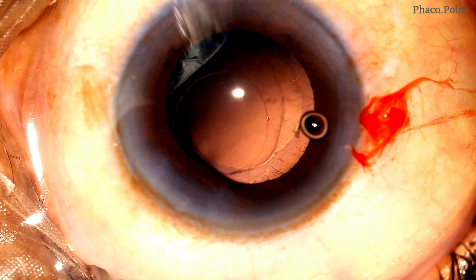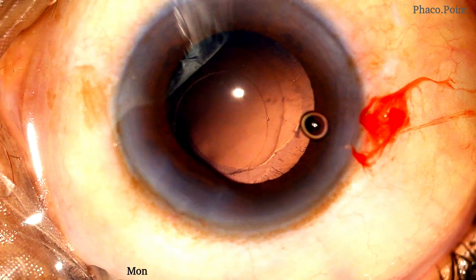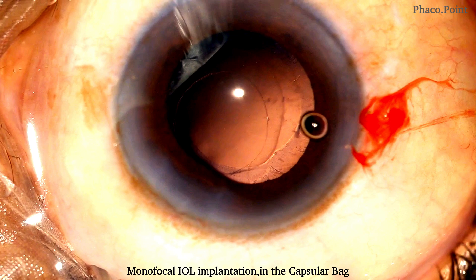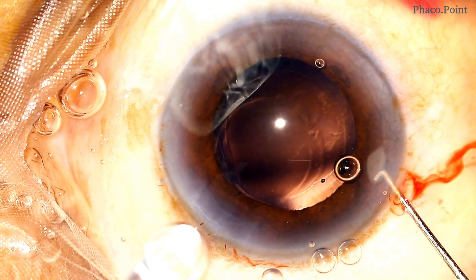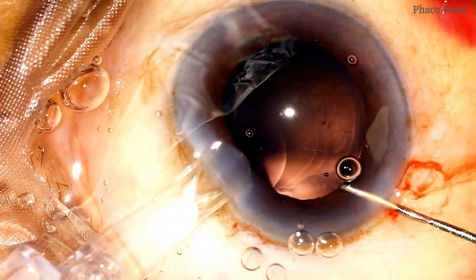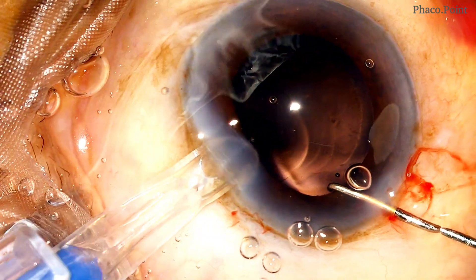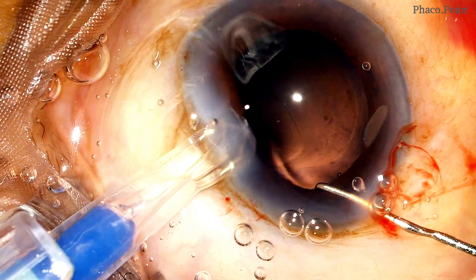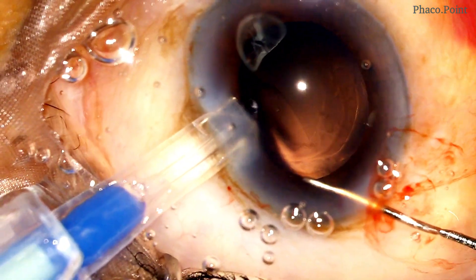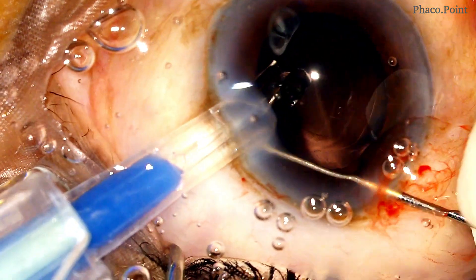Fortunately in this case there was hardly any cortex, so we proceed directly to the implantation of a monofocal IOL in the capsular bag. Under adequate viscoelastic cover, let's watch the implantation of the monofocal IOL in the capsular bag.